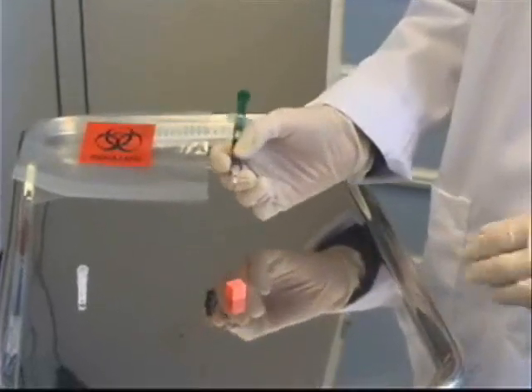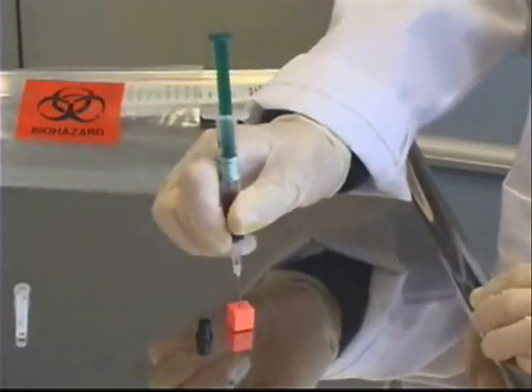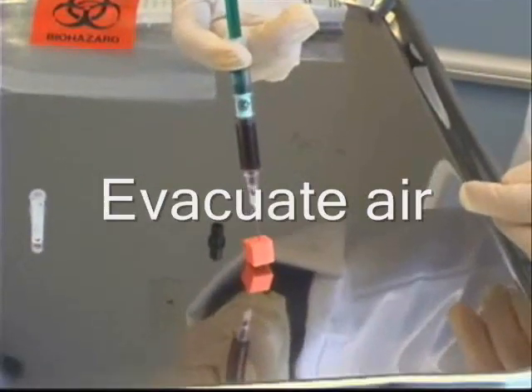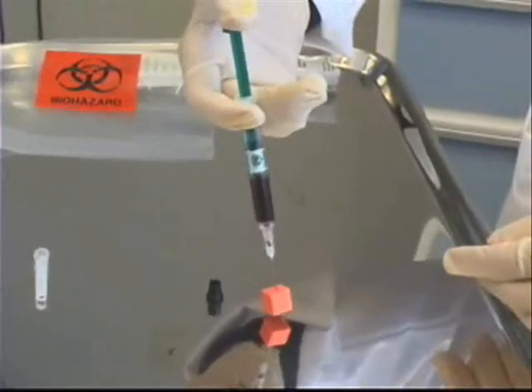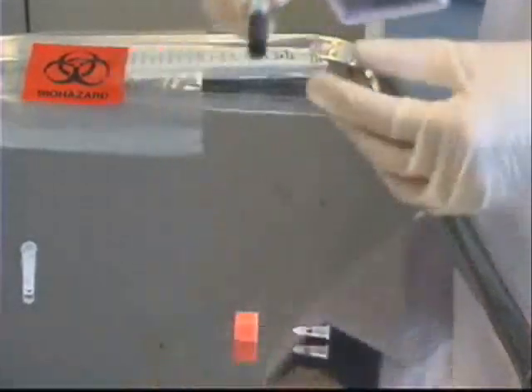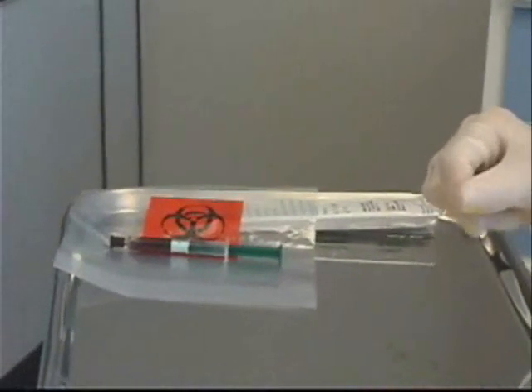While my patient is holding pressure over the site, I'm going to take my needle and syringe over to the air cube and insert the needle straight up and down into the cube — far enough that the bevel is covered, but not so far it goes through the entire cube. I'll then push down on the plunger to expel any extra air that might have gotten into the syringe and could affect the results. I can then remove the cube and needle as one, attach the black cap to the tip of the syringe, give it a roll to make sure the heparin has dissolved, and place it into the bag of ice to send to the lab.